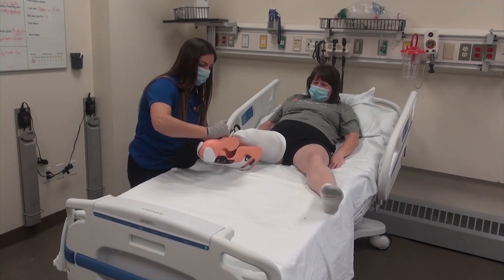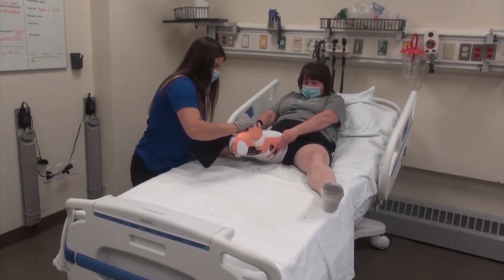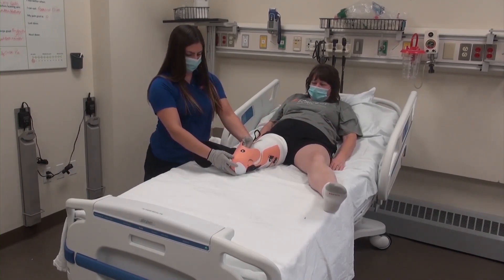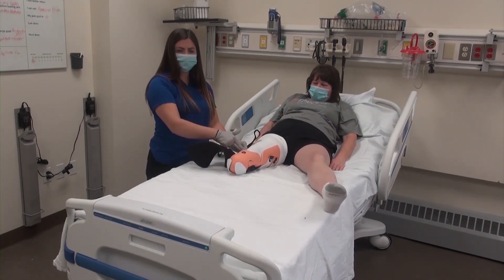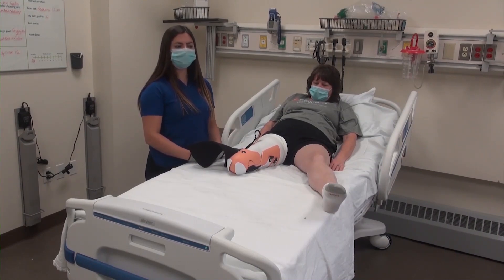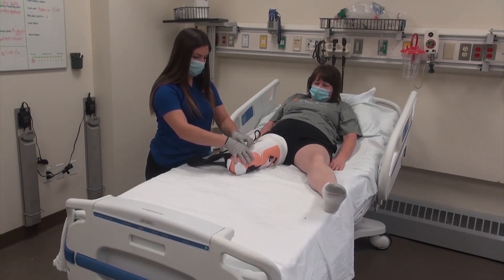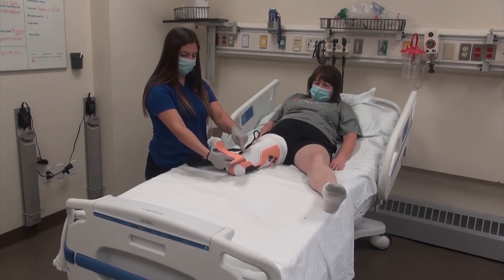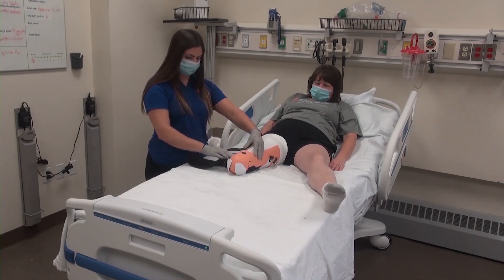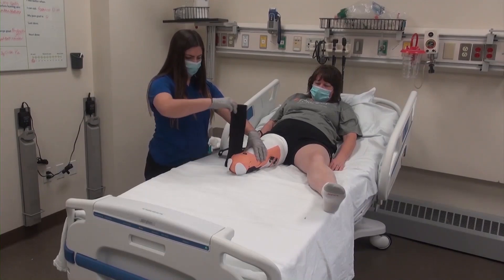To don the rigid removable dressing, the patient may need to assist in lifting the leg, or help may be necessary from a medical staff member. Once lifted, slide the Kiwi under the patient's leg until the foam curved portion is sitting just distal to the patella — this resembles a smile under the patella. Peel back the distal anterior foam and ensure the limb is sitting just superior to the memory foam and not making heavy contact with it. From there, tuck the foam into itself comfortably snug against the limb and overlap the black piece of material to secure with velcro.